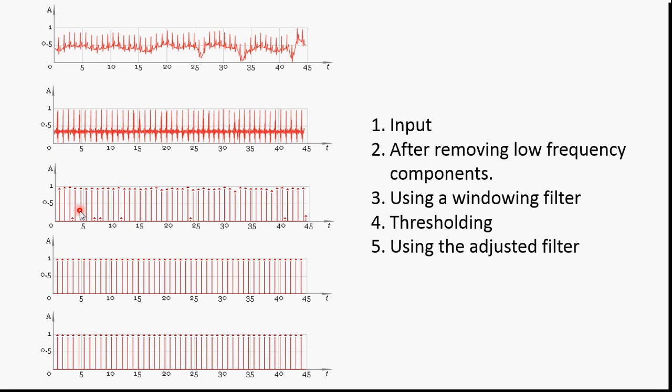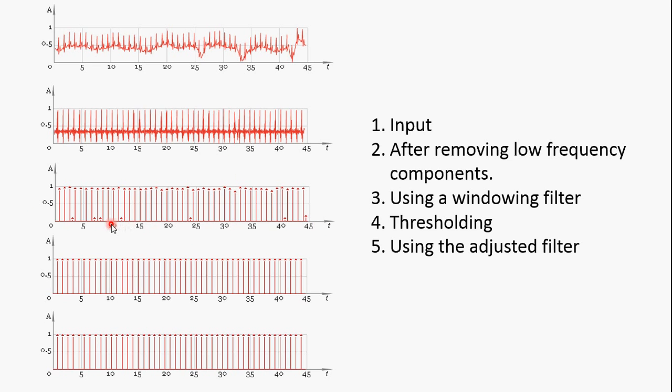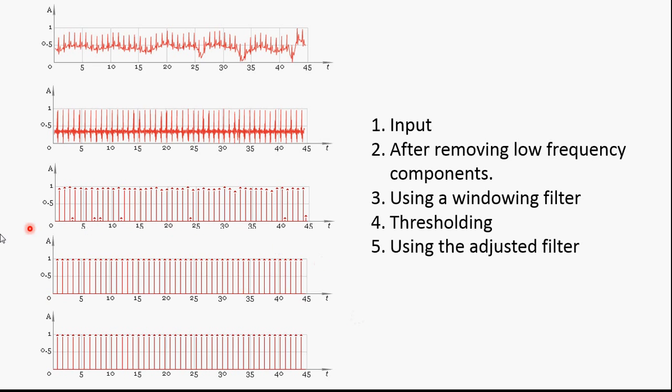After using the windowed filter to detect the peaks, the signal looks like this. Now you threshold, removing the small peaks and storing only the significant peaks. Now the signal looks like this.